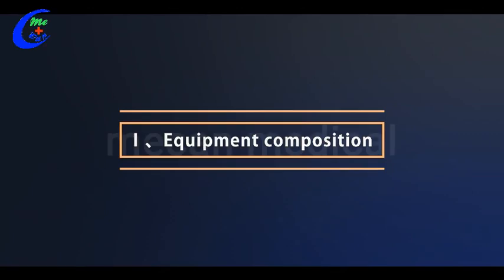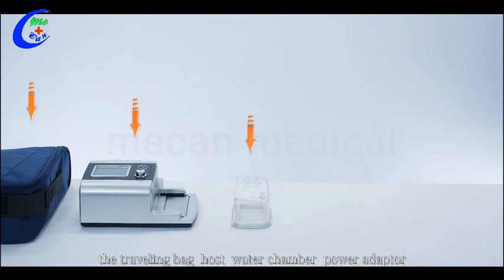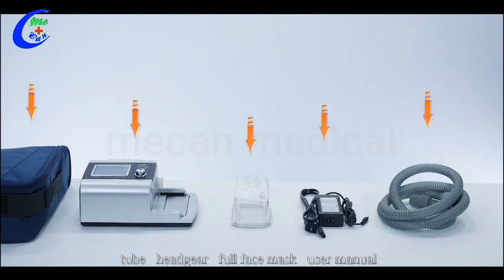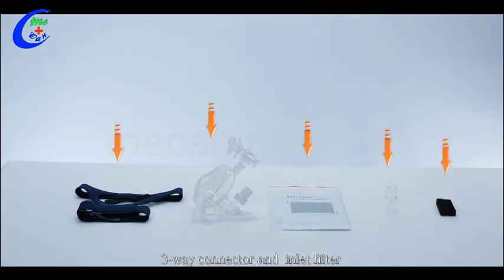Equipment composition. Our accessories include the traveling bag, host, water chamber, power adapter, tube, headgear, full face mask, user manual, three-way connector, and an inlet filter.